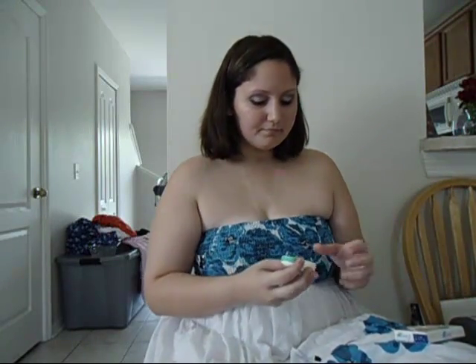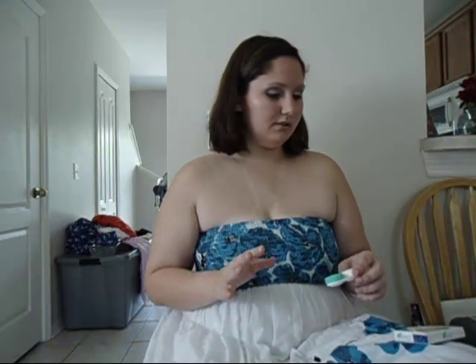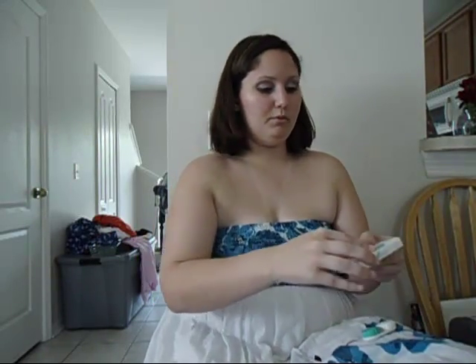Next, you want to make sure you have a contact case, which looks like this. They come in different varieties, styles, and colors. You can normally find these for like a dollar or so at the store, or you can get a big pack of them for maybe four or five dollars. When you open up your box of contacts, they come in these little individual cases with your contact already floating in some contact solution.